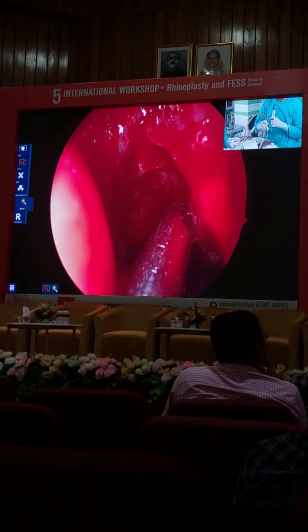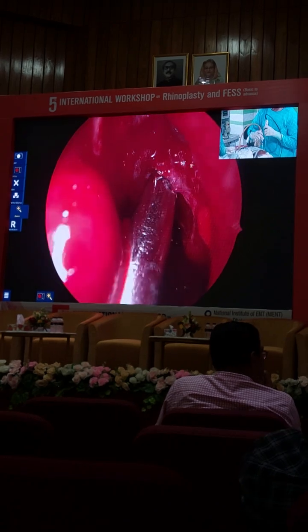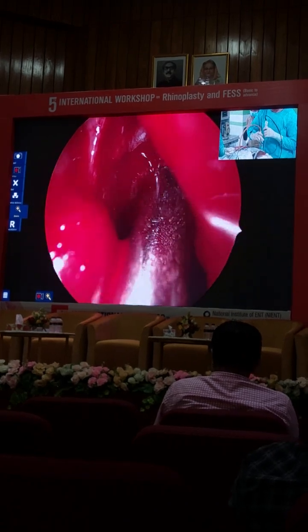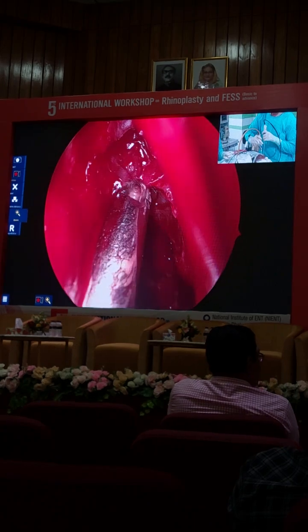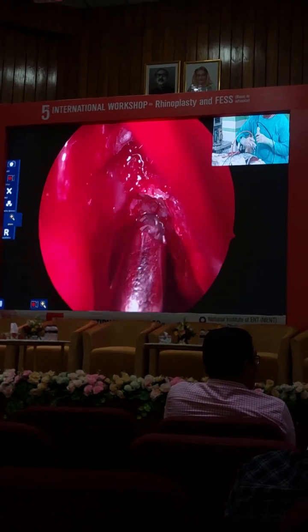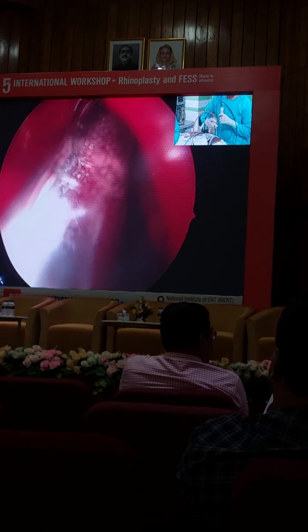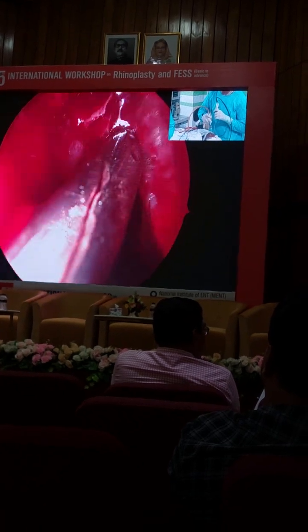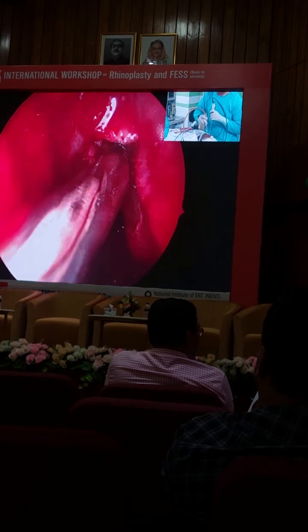So you see with a 40, it's so much easier for me to work on the lateral part, right? Without putting pressure on any bone immediately. These are all some bone pieces of that ethmoid. And here I am at the orbit. Can you see now?